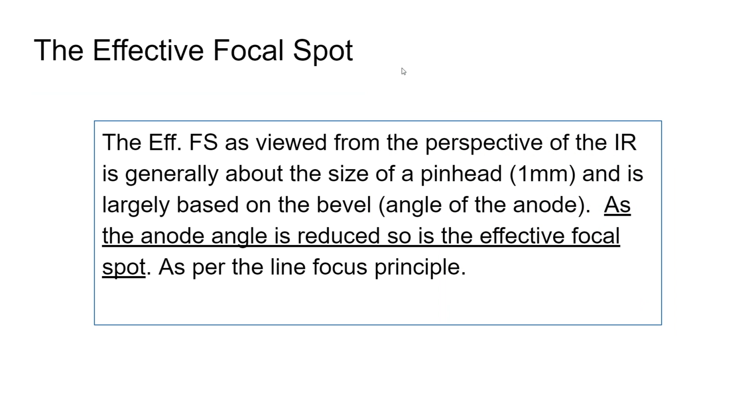The effective focal spot, though, is not really a physical thing. You can't touch it. Right?